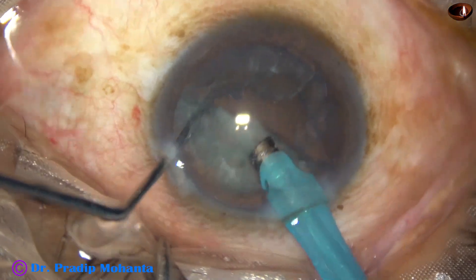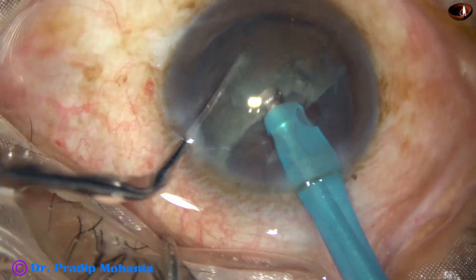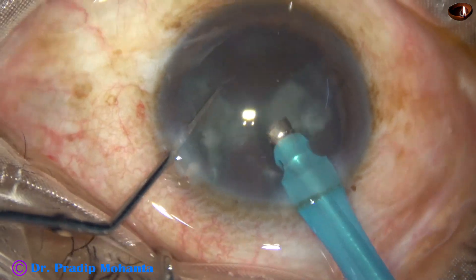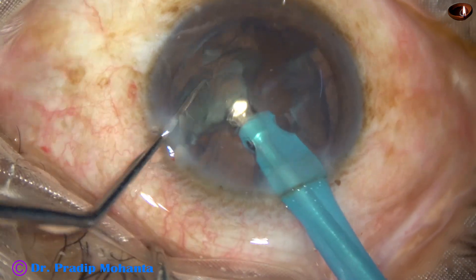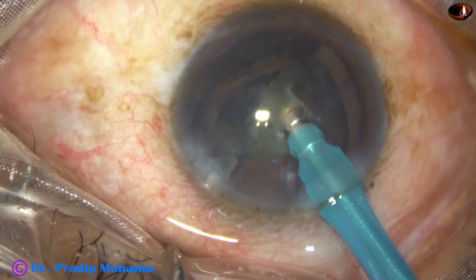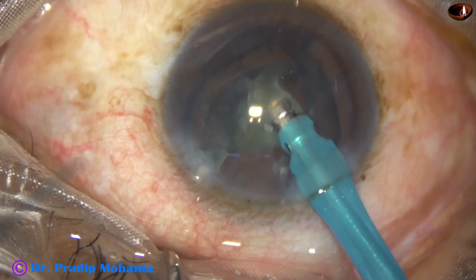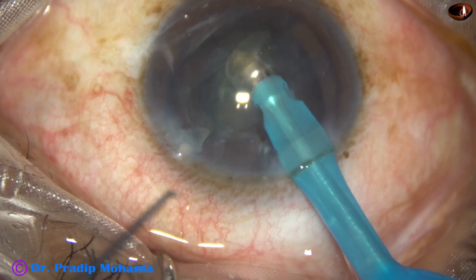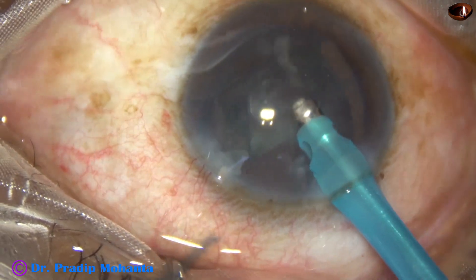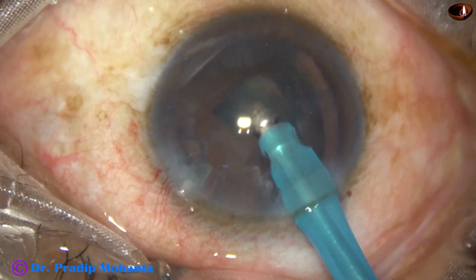One hemi-nucleus has been managed. Now go to the other side. At this time, the vacuum is 350 mmHg, flow rate is 35 ml per minute, and ultrasonic energy is the same, 60%. This is the last piece. We can now reduce the vacuum to about 150 and flow rate to about 25, and do a very safe surgery by the stop-and-chop technique.